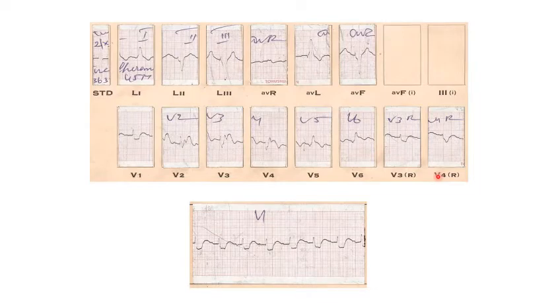If you look at the right bundle branch block pattern, which part of the QRS complex is altered? In right bundle branch block, the initial part of the QRS complex is normal, while the later part of the QRS complex, the terminal part, is altered. Yes, sir. In a patient with LBBB, the initial as well as the terminal part, both are affected.